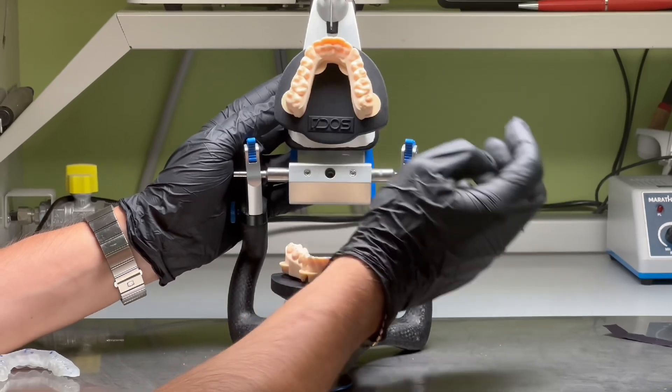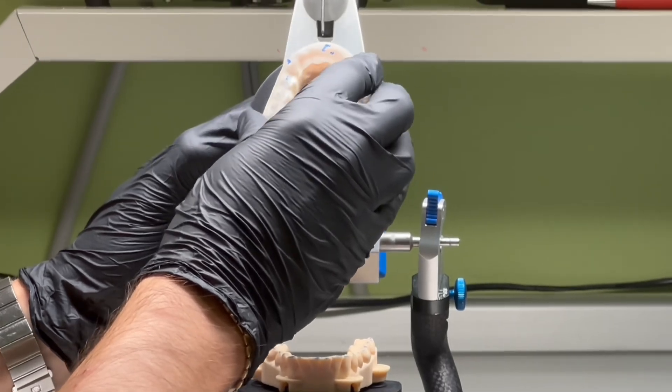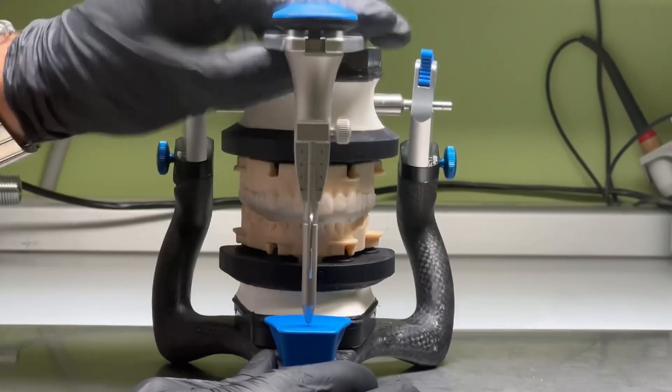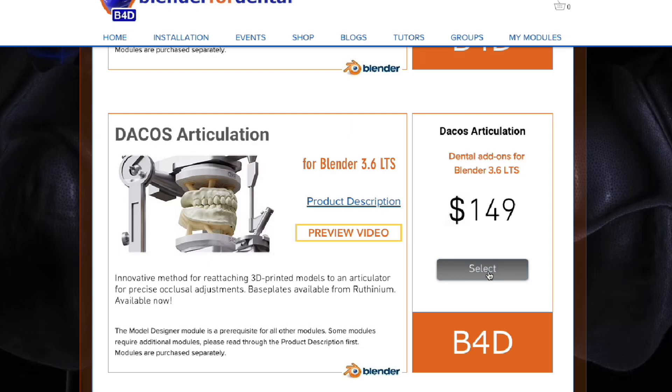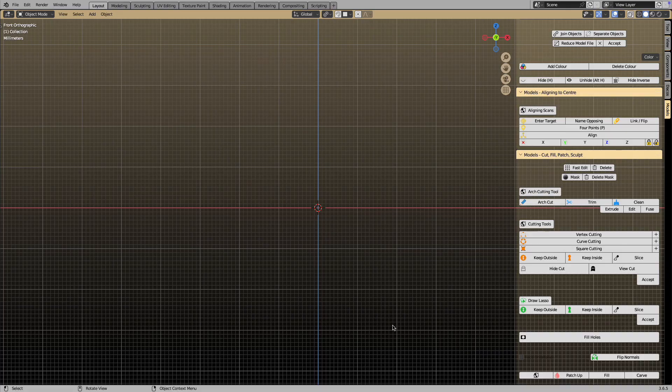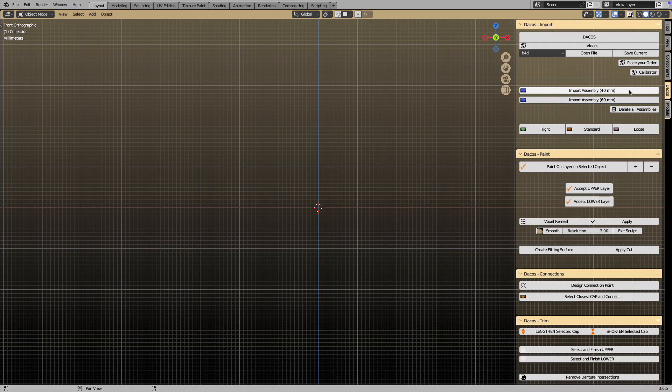In this video tutorial, we will guide you through the installation of the Dacos plate into your articulator. After purchasing the Dacos module on the Blender for Dental website, you can download the Dacos Master Calibrator STL files.